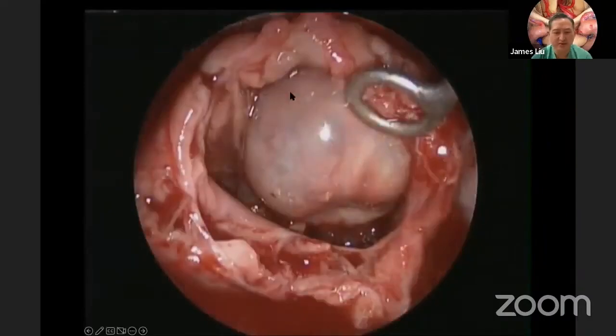And once we remove the tumor, you can see this is the descent of the sellar barrier. The sellar barrier is defined as the arachnoid membrane that protects the CSF space above. And the sellar barrier can be made of the arachnoid membrane. And there's also variable thicknesses of the gland, the normal pituitary gland that is on that arachnoid membrane. A lot of people call this the diaphragm.